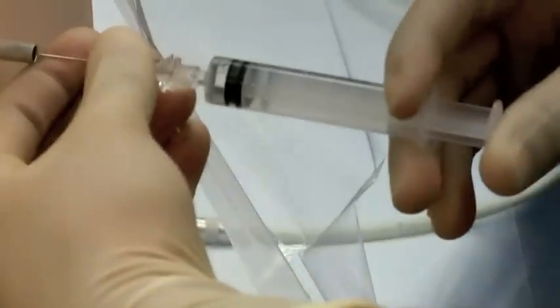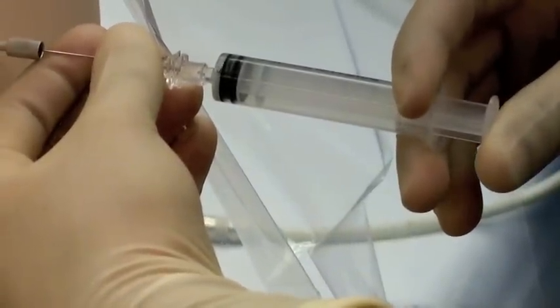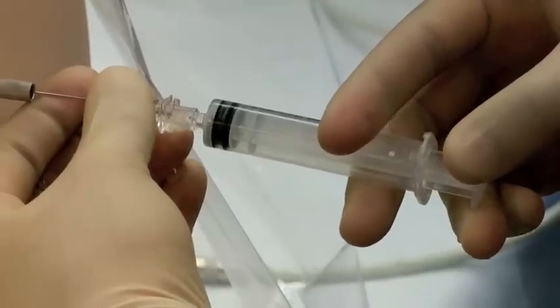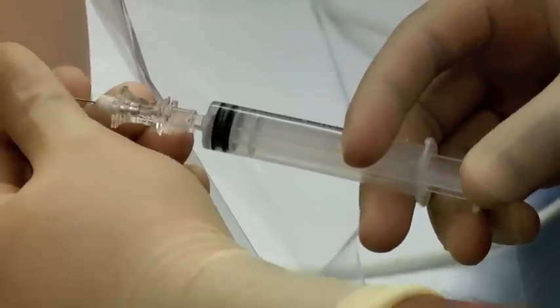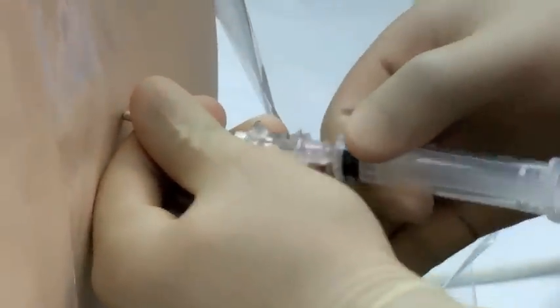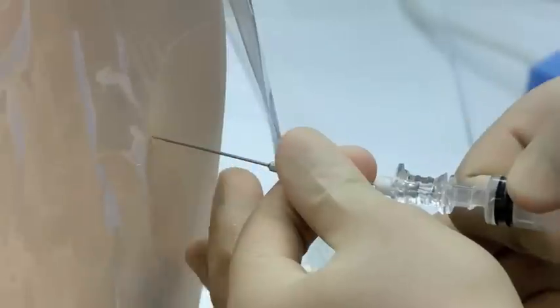Inject the medicine slowly. And then at the very end, after injecting, I'm going to aspirate one more time to confirm I'm in the CSF space. And I am. And all at once, I'm going to pull out the introducer needle, the spinal needle, and the syringe. Apply pressure with the provided 2x2 gauze, assess for good hemostasis, and apply bandage.